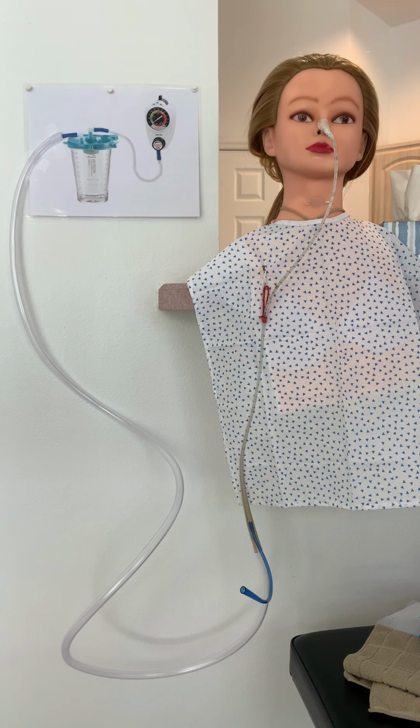And I want to chart the reason the tube was inserted, the type of tube inserted, the type of suction and pressure setting, color, consistency, odor, and amount of aspirate and drainage, the client's tolerance to the procedure, the effectiveness of the intervention.